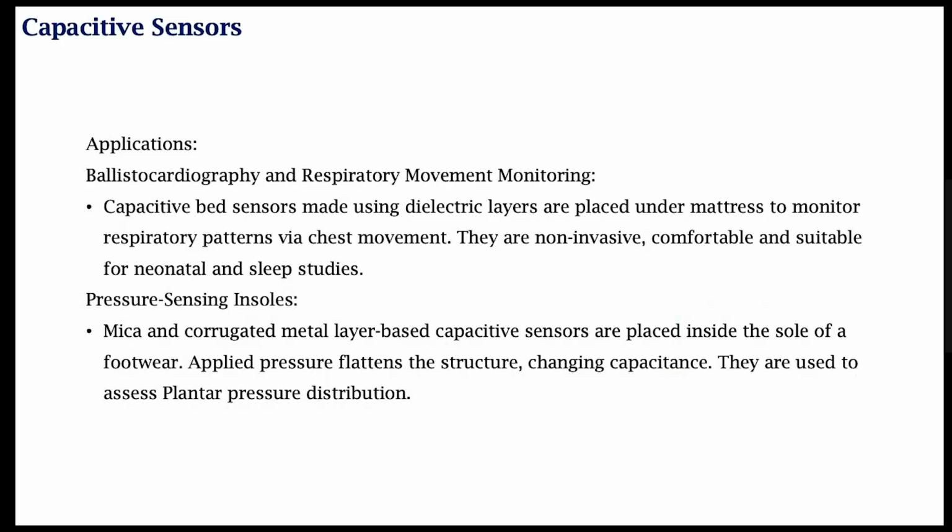What are some of the applications of this capacitive sensors? Now, I already mentioned one of the applications, that is the phonocardiography. Another application is ballistocardiography and measuring respiration movement. I'm interested in measuring respiration rate in a bedridden patient.